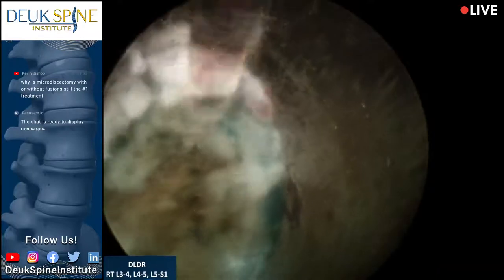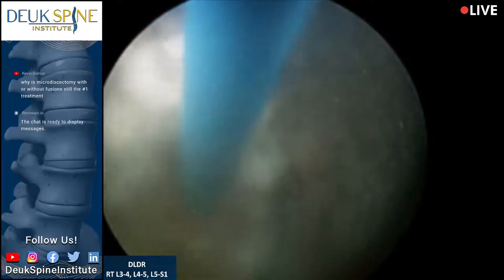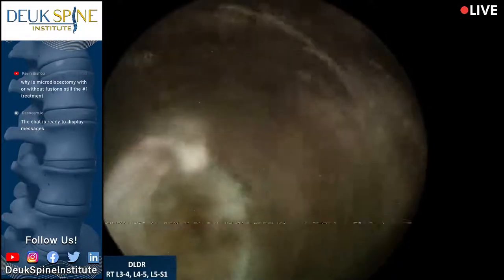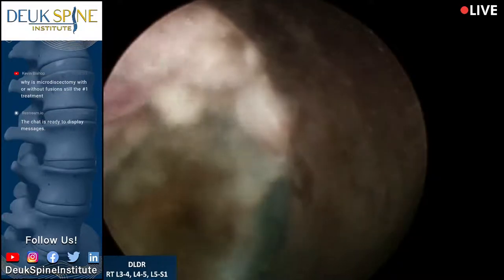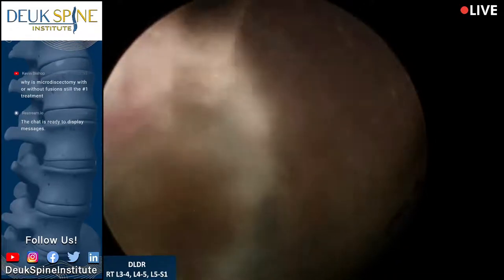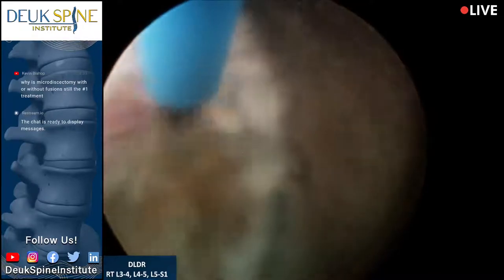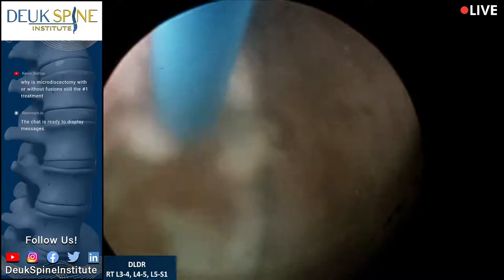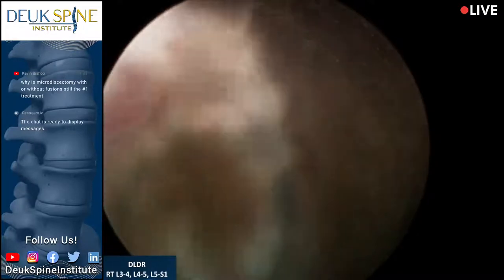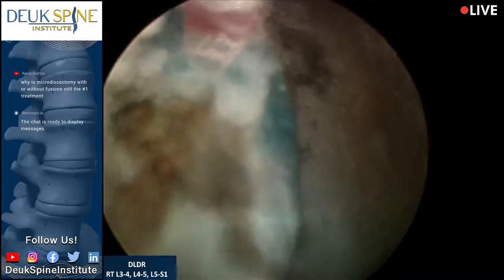All right, just about done here. Once again, this is the L5-S1 that we're working on. I'm going to pull back, take a look. I'm going to try to work a little bit between these guys. All right, I'm pretty happy with that. Looks good. We're done here at L5-S1.